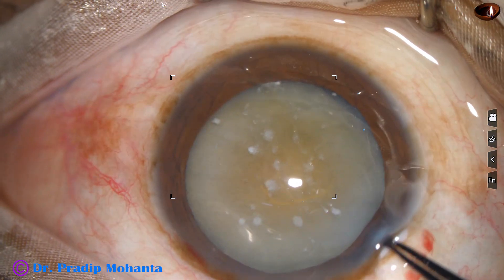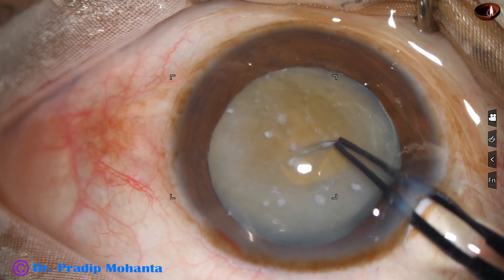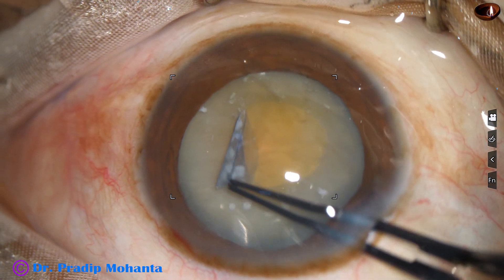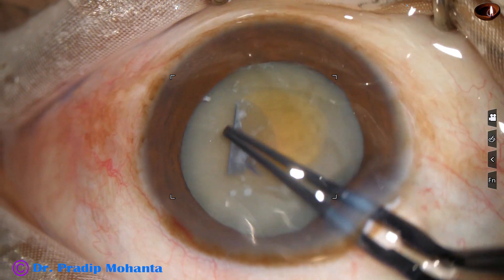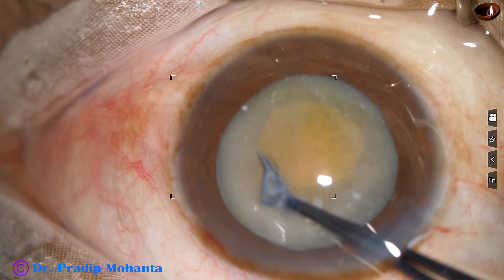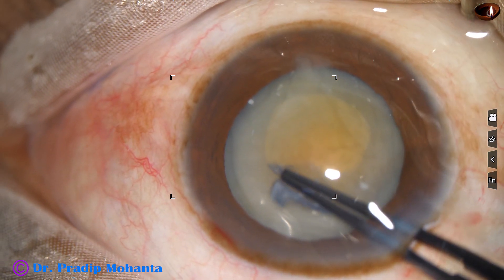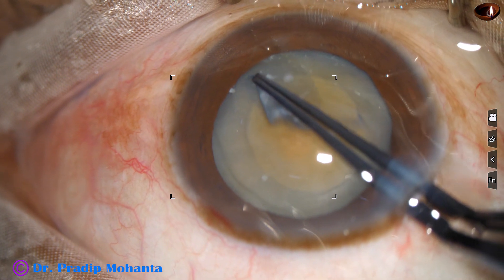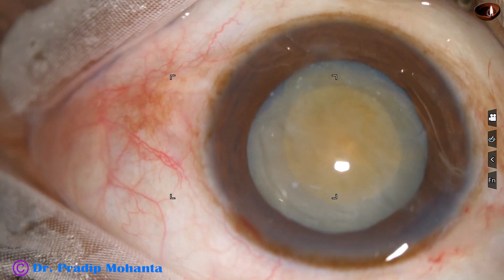Now inject VISCO, hold the capsular tag and do a rhexis. In this case, I am intentionally doing a small rhexis because if I go to the periphery and it reaches the zonule, I will have a very tough time.